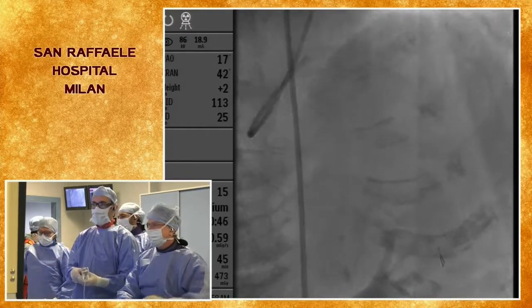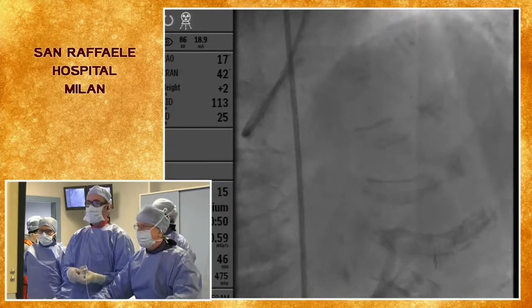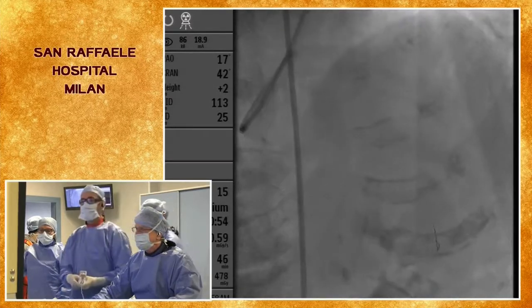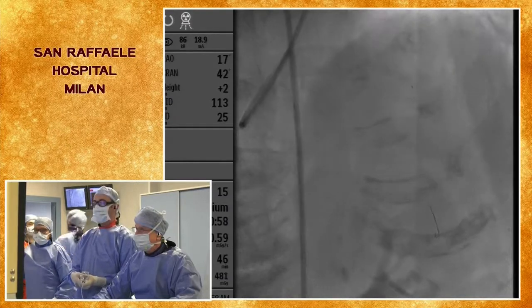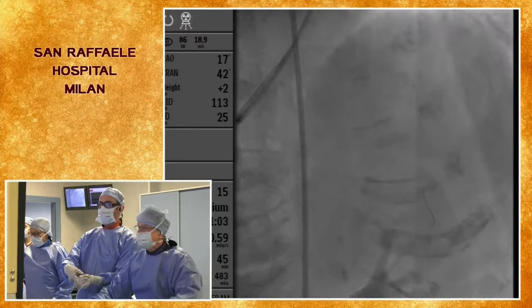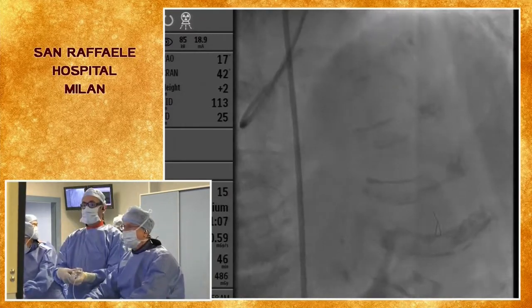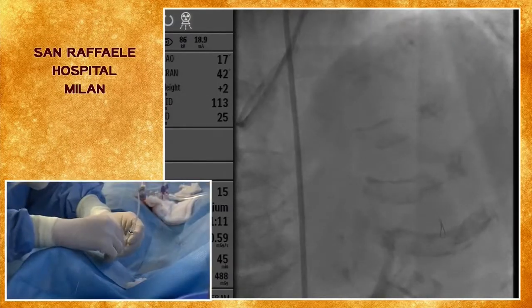I don't want to take any chance. Maybe we even need a microcatheter or a new balloon. A smaller, short balloon, maybe. This balloon has already been inflated. We got a fine cross? What do you think? Let's use a monorail. Can we use a monorail balloon to dilate?